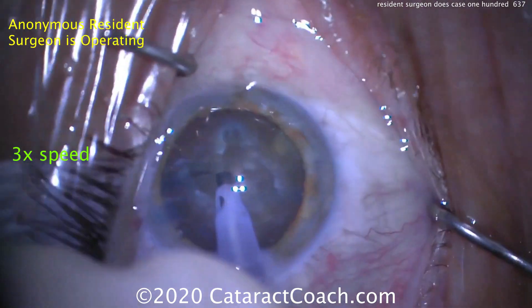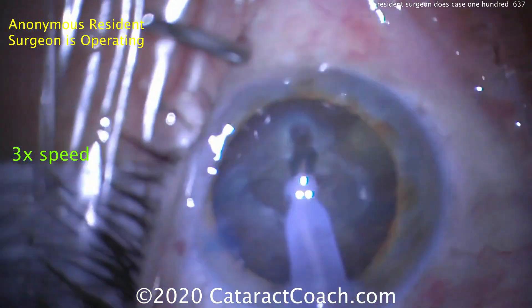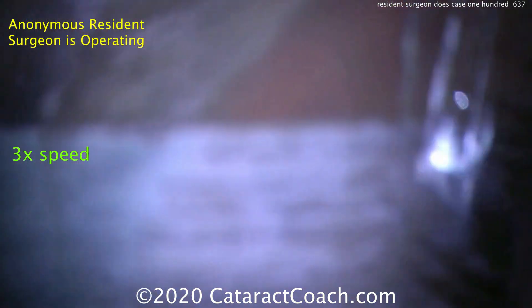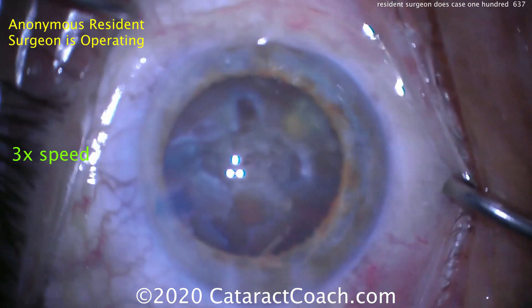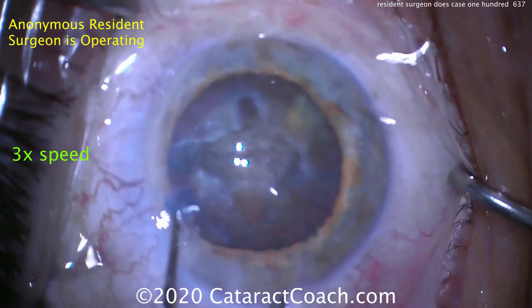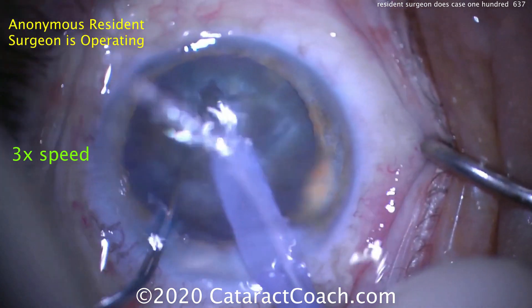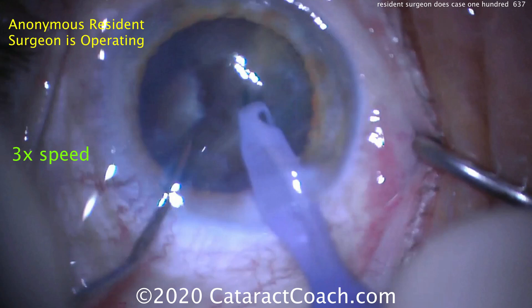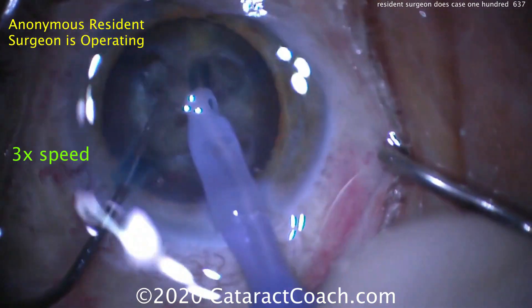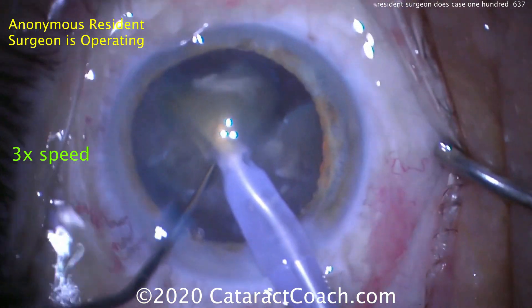Continuing that groove that's being sculpted here. That looks pretty good. Again, there's a lot of patient movement here, so it's not the fault of the resident surgeon. But I'd encourage the anesthesiologist to be a little more generous with that systemic sedation. The patient's probably received some good local anesthetics such as a block; however, systemically, the patient's still moving his or her head around.